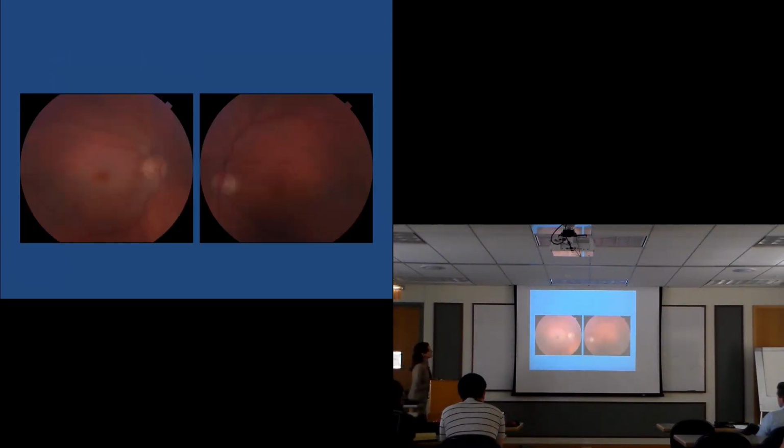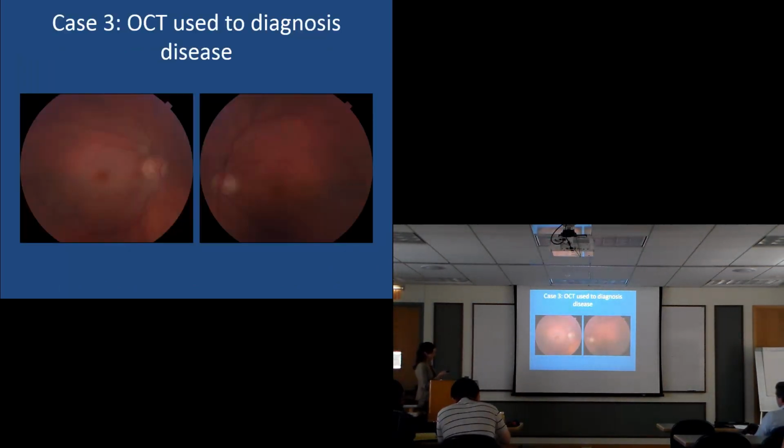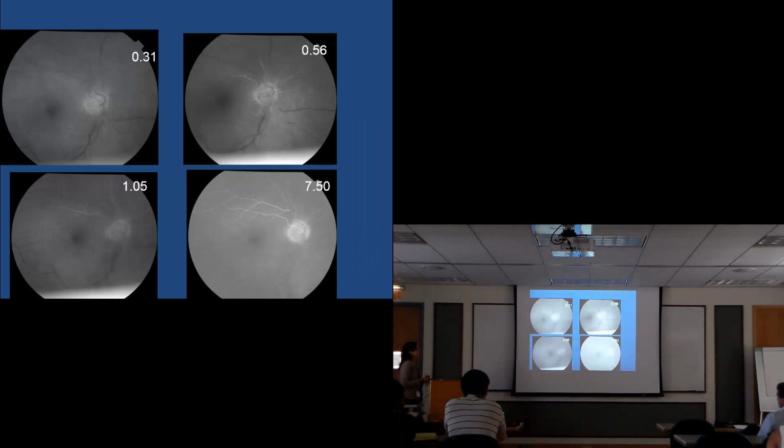This might be hard to see here, but this is how OCT diagnoses a disease. Again, hard for you guys to see and hard for the clinician, but this artery is occluded, there's no blood flow in this lower artery. We can see that because, as we know the anatomy, retinal arterial and venous blood flow supplies the inner retina, and choroidal blood flow supplies the outer retina. So this edema and swelling is all because there is basically a stroke in the inner eye causing that swelling in the inner retina. This patient goes completely blind. This is a blinding disease, because just like a stroke in the brain, you can lose that vision. This patient, unfortunately, wherever that is, becomes completely dark and we're not able to replace it.